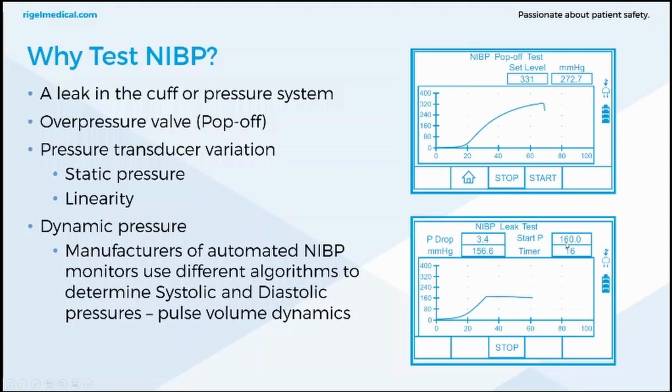It might specify a start pressure of 160 millimeters of mercury and a pressure drop of, say, 5 millimeters of mercury over 2 minutes. That's just an example. As long as it falls within those values, then it's within specification. So you must refer to the manufacturer.